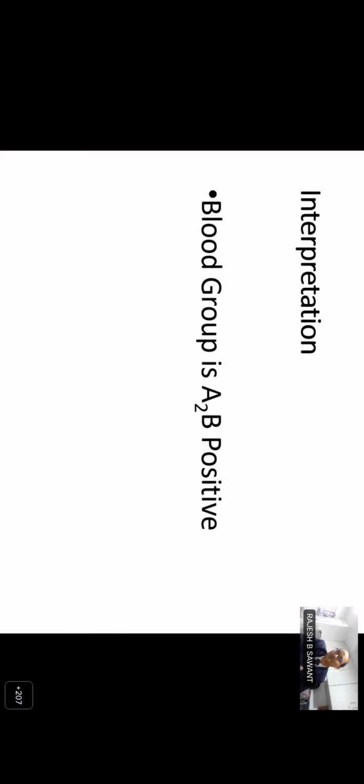The second thing you asked about is whether all centers will do this. It's very important to choose the blood center where you are sending or referring your patient for transfusion support. All the hospital-based blood centers, which are very strictly governed by the FDA, definitely follow this forward and reverse typing and also the major and minor cross matching. So this kind of discrepancy or subgroup will easily be identified by them. But the standalone blood centers, I really can't guarantee whether they will go into the depth of this, and that is where these things can be missed. Many times this is what happens: the standalone dialysis centers don't have their own blood bank, and they get the blood from wherever.